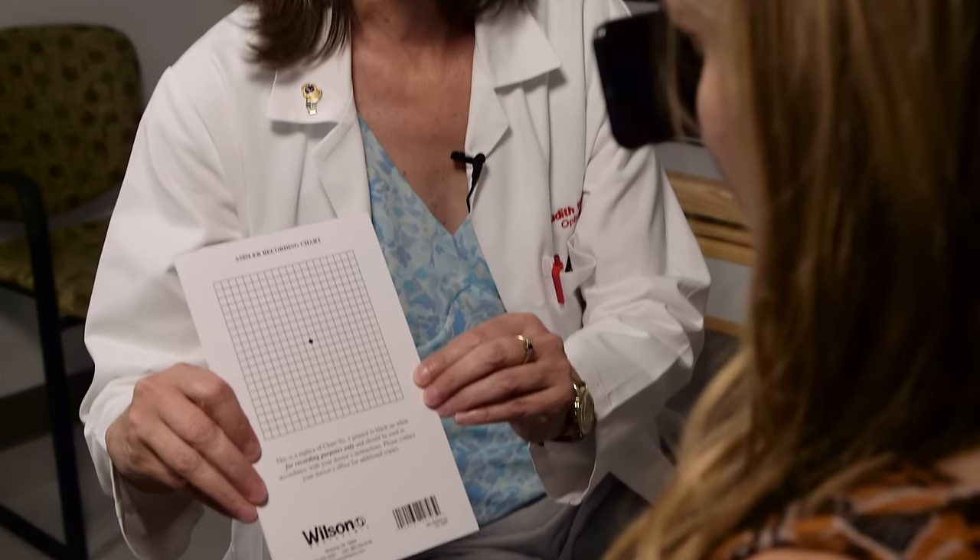Normally we would do this with near correction. Switch around to the other eye. Same thing — while you're looking at the dot, anything missing, wavy, or distorted? No. It's all good? Absolutely wonderful.